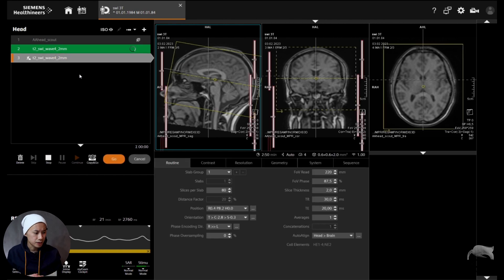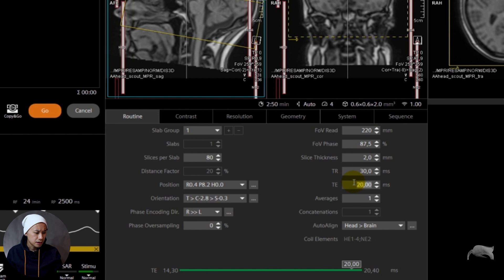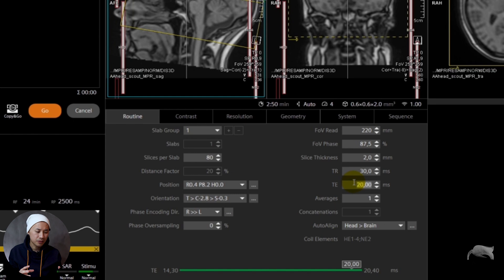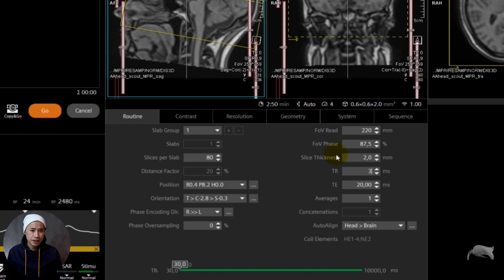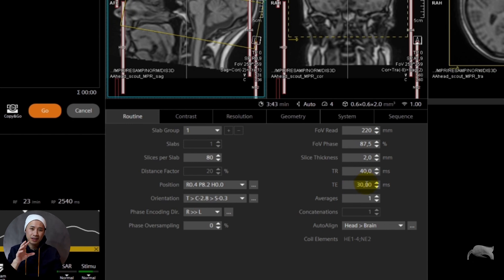So the second one is the modified one. I'll just write 'modify' here so we can see the differences. The thing I'm gonna change is the TE. The TE is a parameter I'm not usually touching when it comes to SWI — we usually use it as it is. But let's change it now and you will see the differences. I want to change the TE to 30. It's locked because the TR is at minimum, so we need to increase the TR to 40, and then we can increase the TE to 30. The main point is the TE.